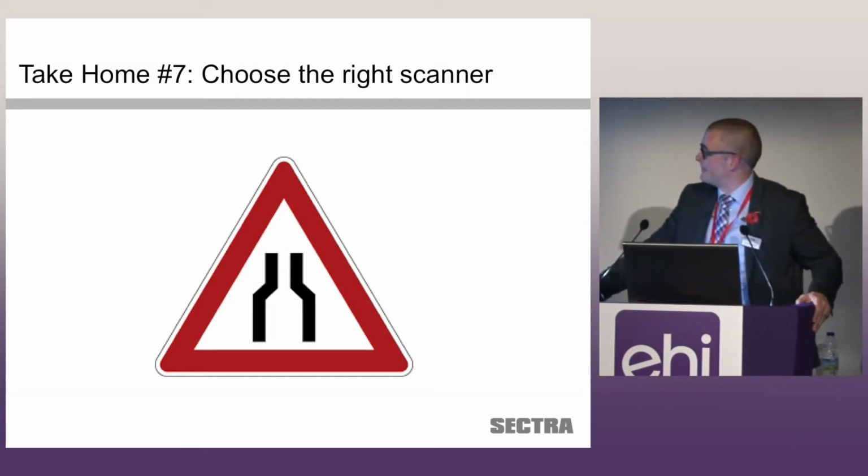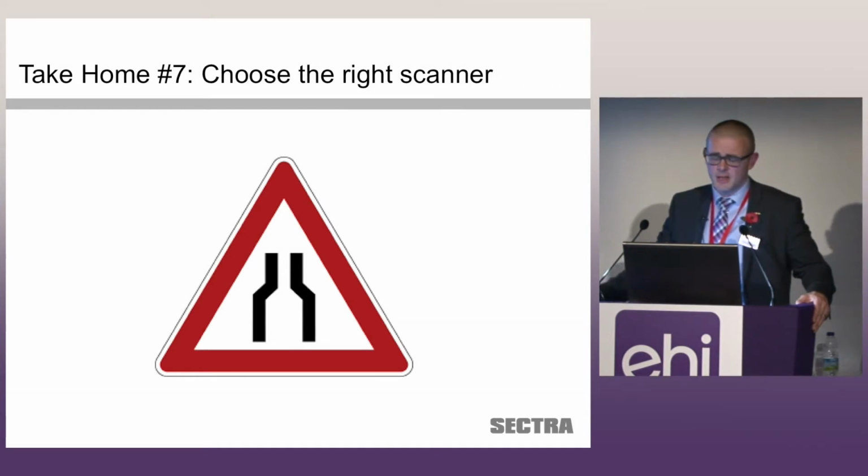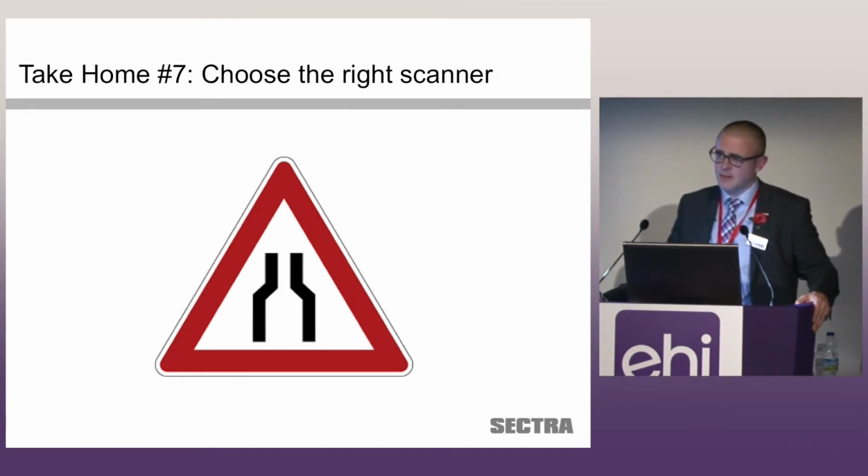Choose the right scanner. And choose your scanner not just for today, but for where you think your department might go in the future. With scanners, you get what you pay for. There are entry-level scanners out there that will digitize a small amount of slides in a particular day, and there are enterprise scanners aimed at much higher throughputs. Really carefully consider what your workload is going to be, both now and in the future, and choose your scanners wisely.